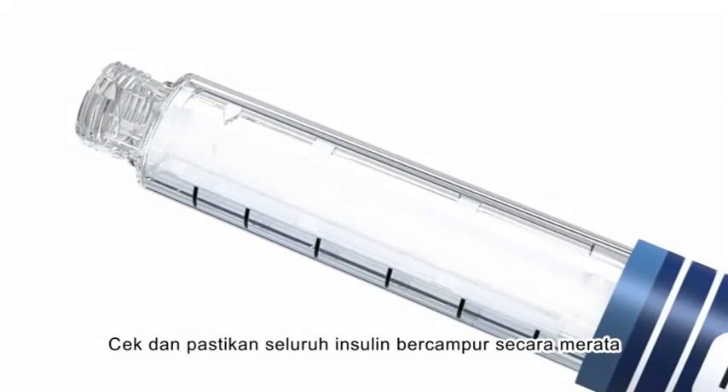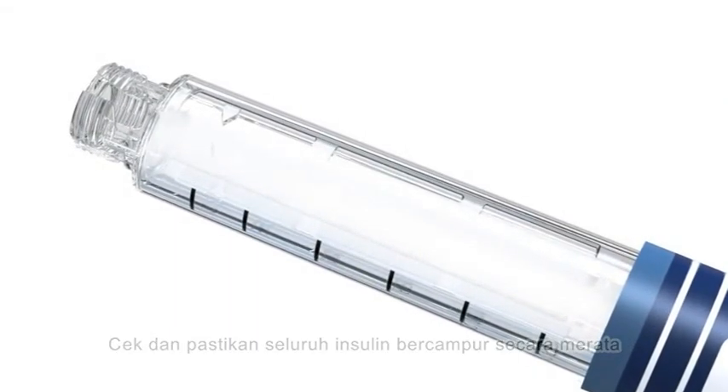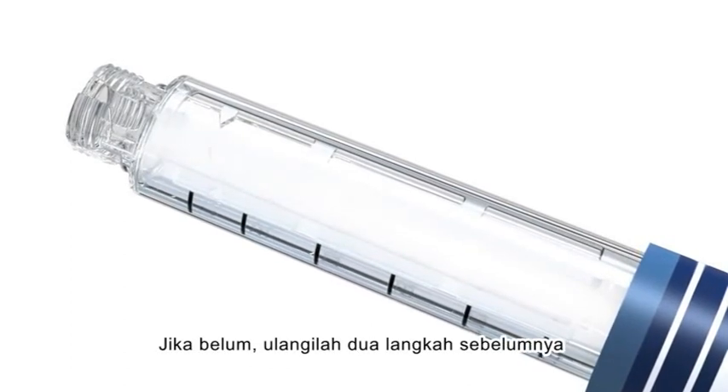Check to ensure that the insulin is uniformly white and cloudy. If not, repeat the previous two steps.